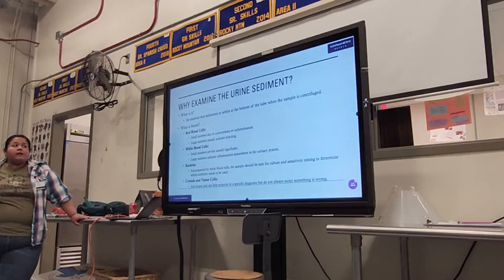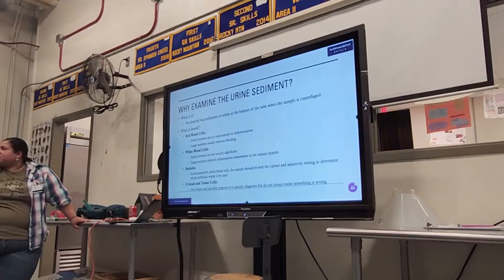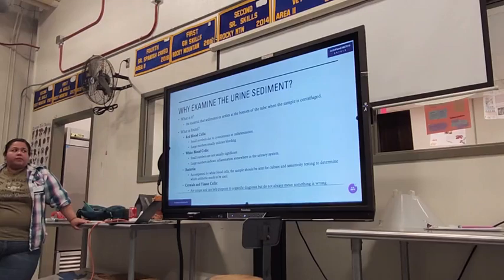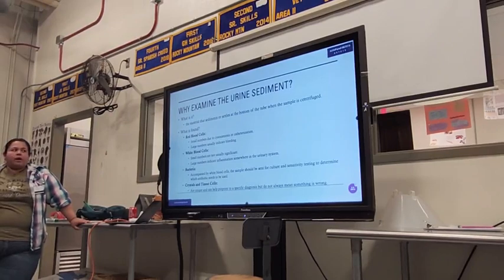Okay, red blood cells in small numbers, typically it's not a bad thing, right? It could be due to the method in which the urine was collected. Okay, if it's in large numbers, then yeah, go ahead and start worrying, right? It usually indicates major bleeding.